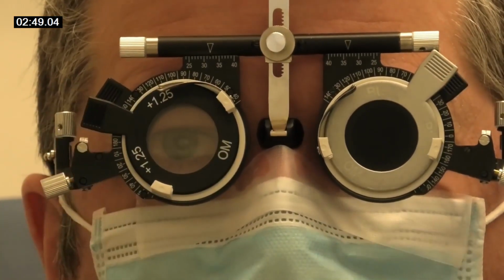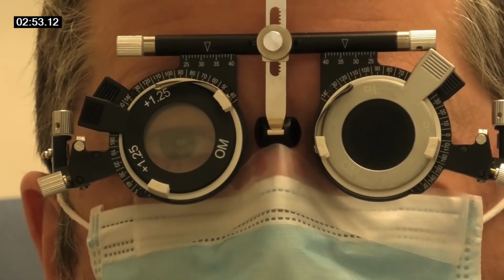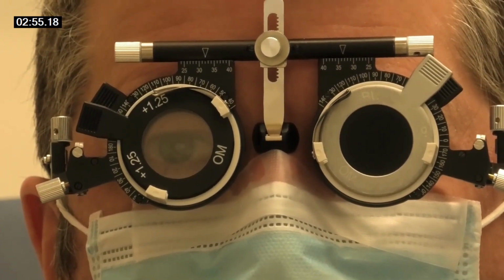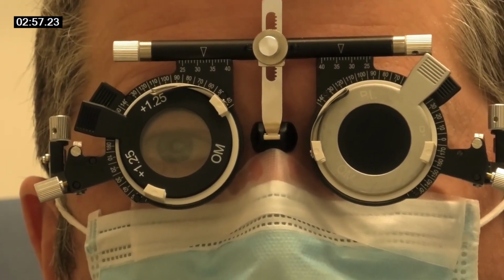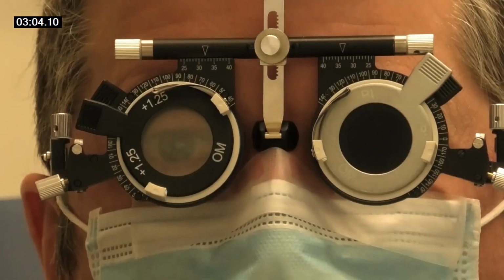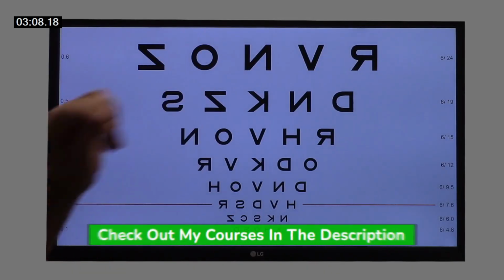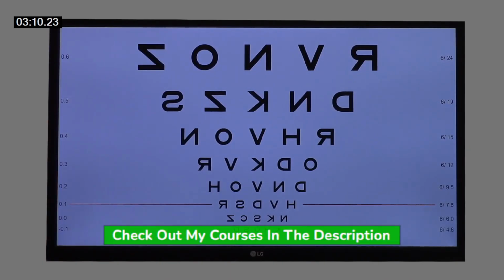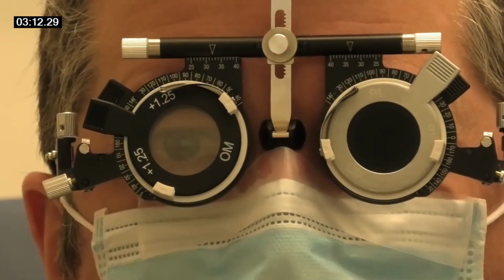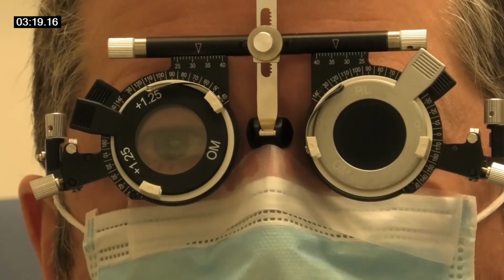So what's occurring now then? You're just blurring it up. You're using, this is like a +1 type thing, isn't it? Yeah. So you want to get it to 6/12. 6/12. That's what you're thinking, yeah. So that's because that's 4 lines different from this one, is it? Yeah. So 1, 2, 3, 4. Okay. And what about now? So the fourth line down, ODKVR. Okay. It's quite blurry.